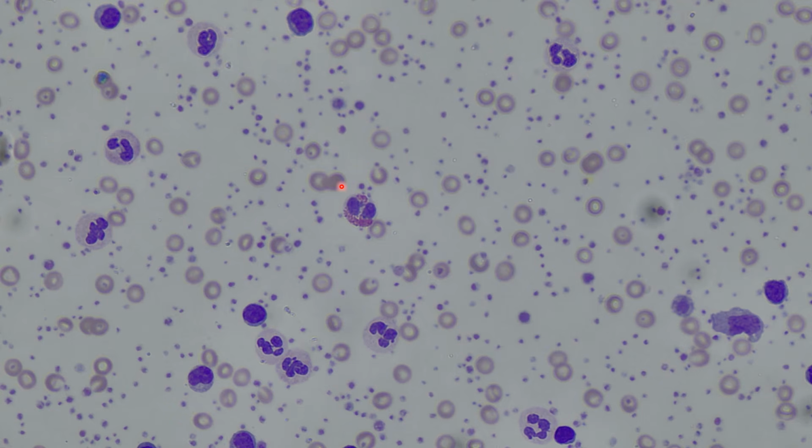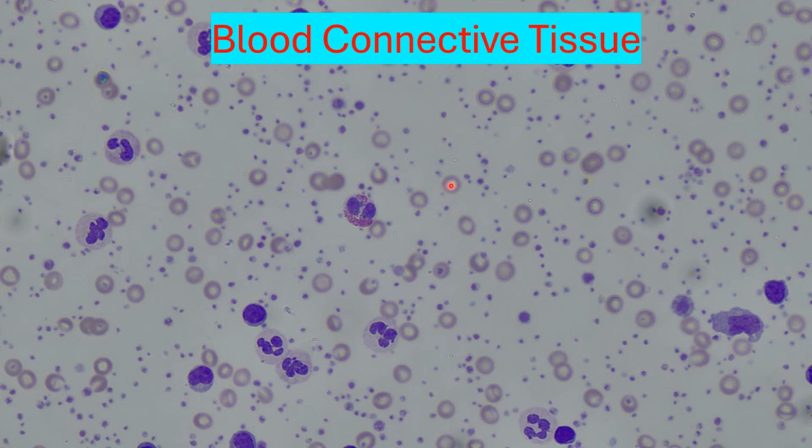This is just a special preparation of blood. Normally we see mostly our red blood cells, our erythrocytes that is, but we see a lot of thrombocytes, the platelets, and leukocytes, the white blood cells. We see those in a higher quantity because we've extracted that from a centrifuge sample of blood, thus the buffy coat where we see more than usual platelets and white blood cells. But this is blood.